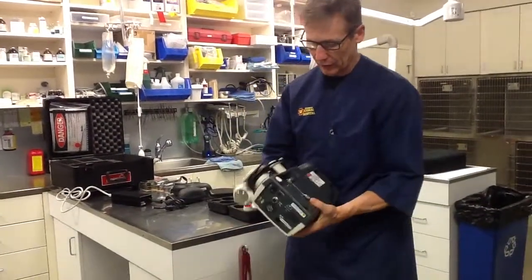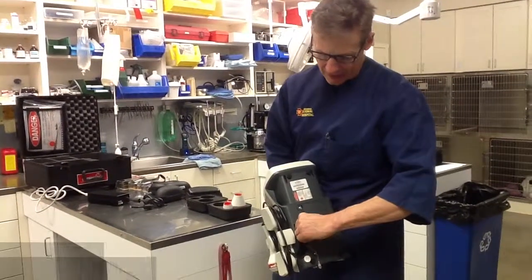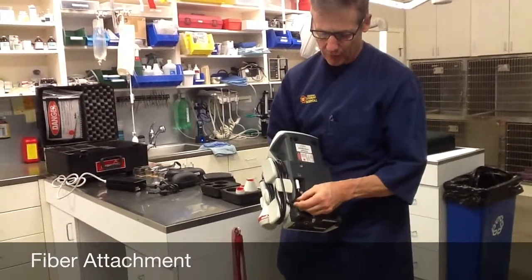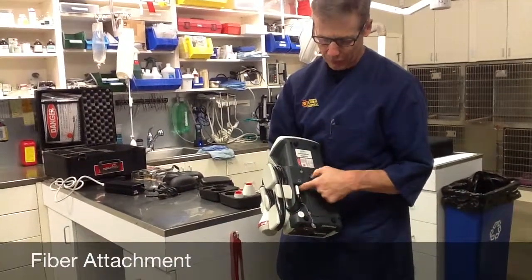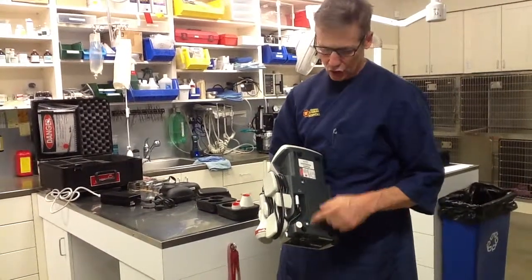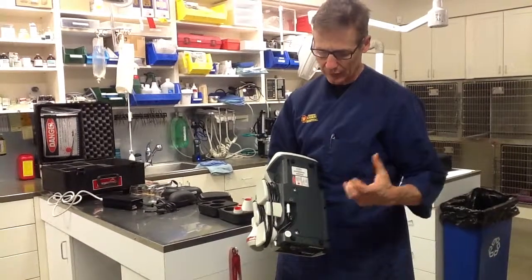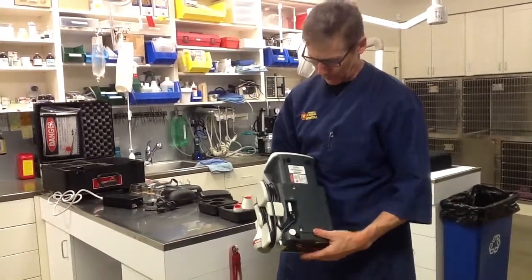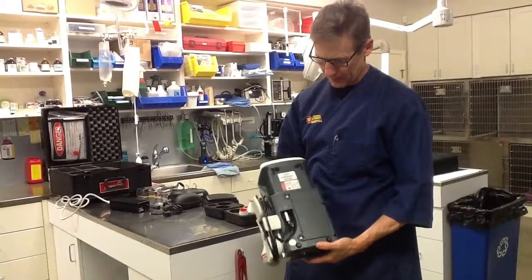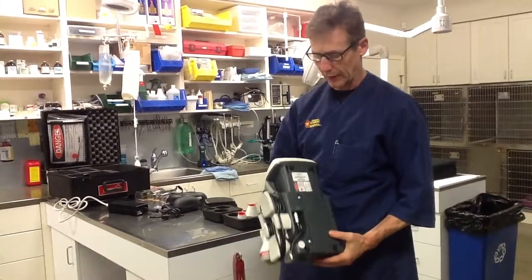On the bottom of the laser, you'll see that the laser fiber attaches in here — always make sure it's finger tight. Next to it, the finger switch plugs in. These two doors are for the battery compartment, so should you need to replace the battery, you undo these and take the battery out. There are a couple of foot pads on the bottom, and your serial number is down here as well.